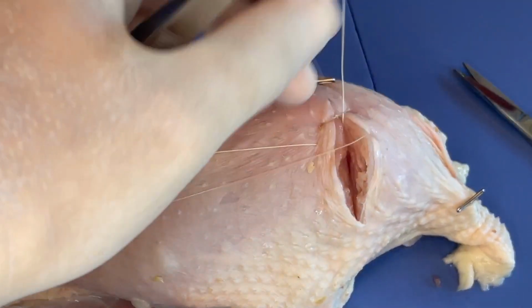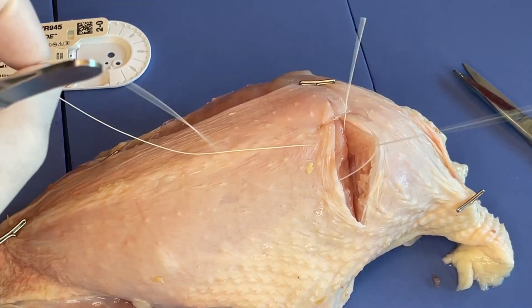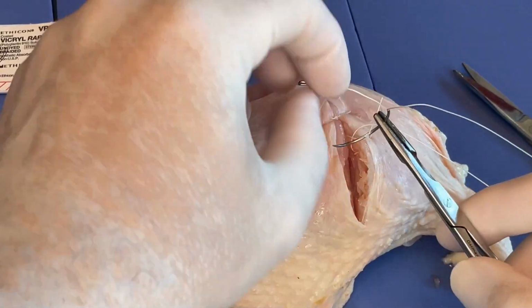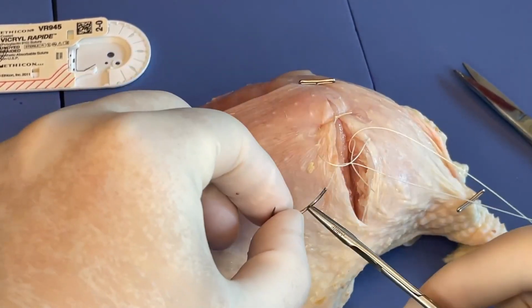So I'm getting caught up on my T-pin. All right, so now as we tie this, what I like to do is get both of these on my side of the loop, so to speak. So we are going to bring this back through.